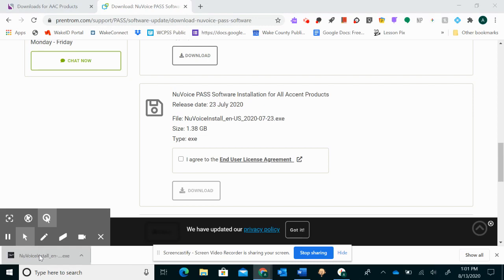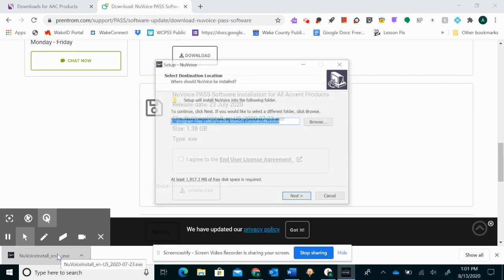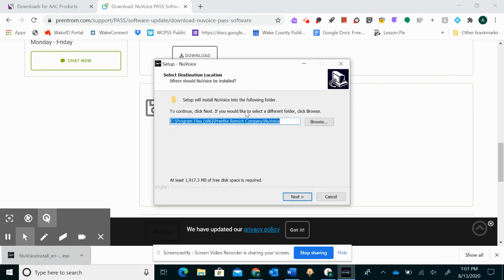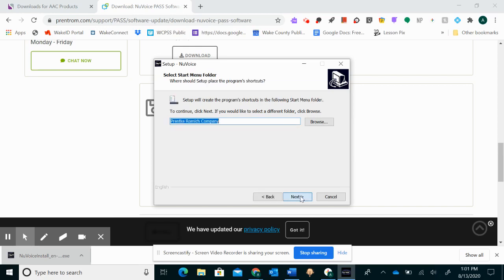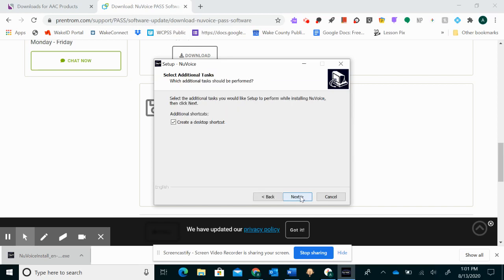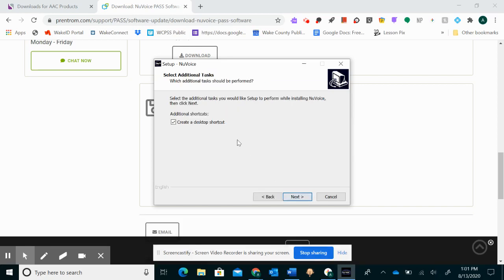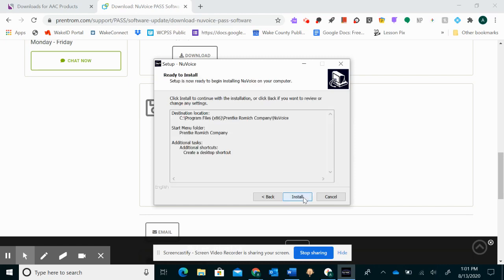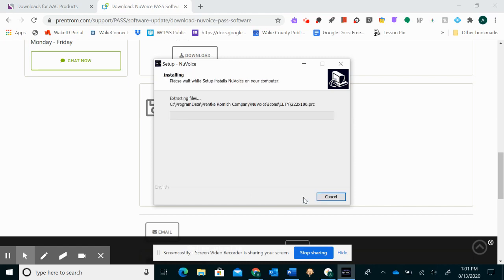It's going to open up. Okay you're going to click next. Next. Probably good to create a desktop shortcut so next install. And this will put all of the features onto your computer.